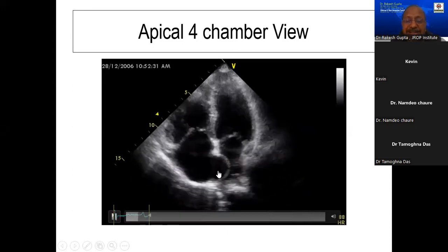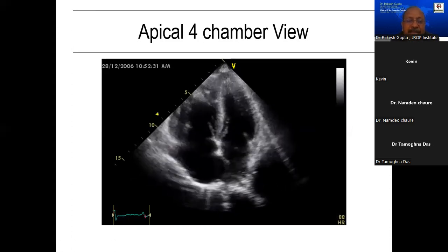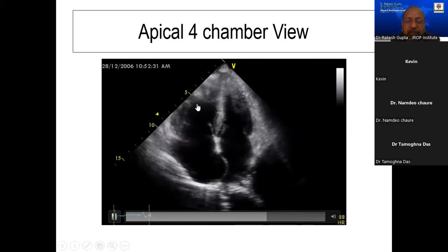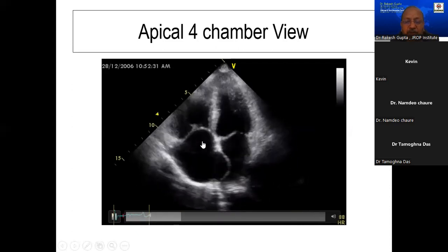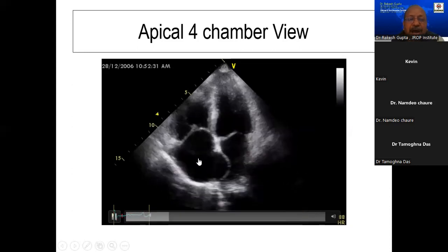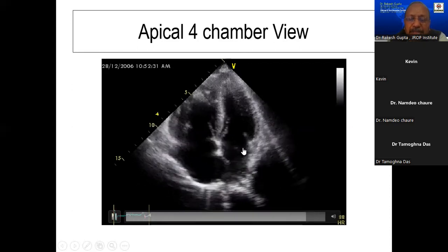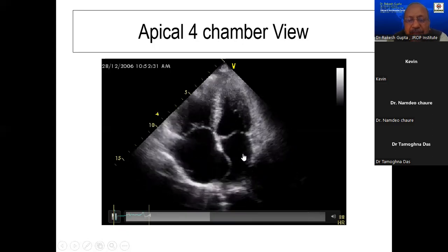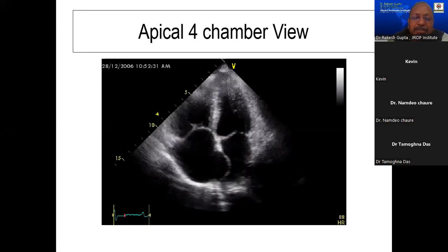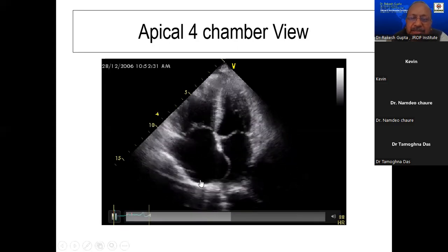So without saying anything quantitatively, by two-dimensional image I can categorically say that this patient has got something wrong with his RV-RA. And in that, I do not know what exactly the problem is, but these two chambers are dilated, and RA pressures are more than LA pressures. And if LA pressures are almost 10 millimeters of mercury, as estimated by diastolic function abnormalities, certainly the RA pressure is more than 10 millimeters of mercury. That's what it suggests.